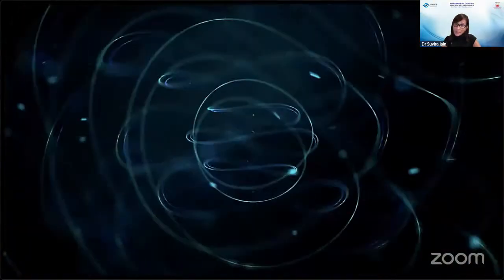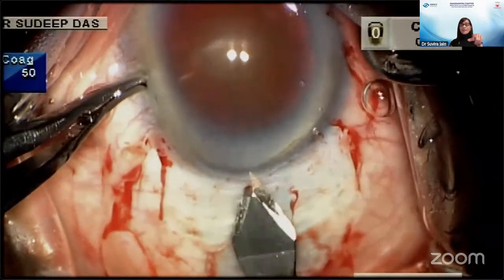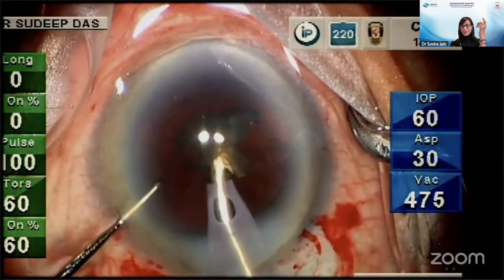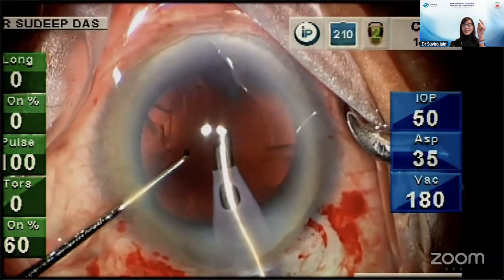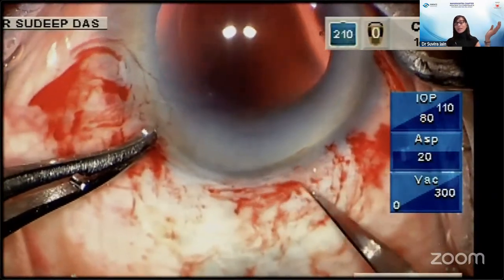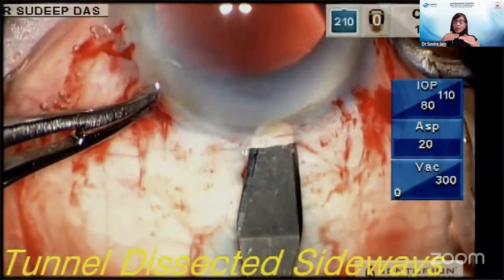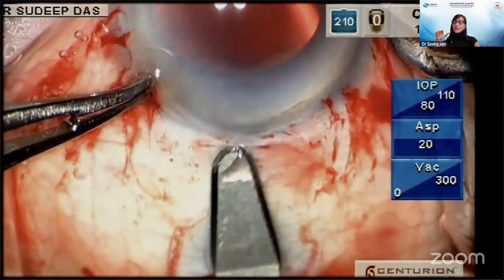Now here's the same surgeon friend of mine who, in this particular case, was performing a scleral tunnel phaco, in a patient with an NS2 with a polar cataract. Now the story can be a little different when you're performing a scleral tunnel phaco. Here, while bringing the last fragment, the surgeon has had a rent. So now, if you were to enlarge this to put in a three-piece lens through a larger tunnel, it's fine because the incision is scleral anyway. You can give back cuts, and you can then extend this into a SICS tunnel very easily.